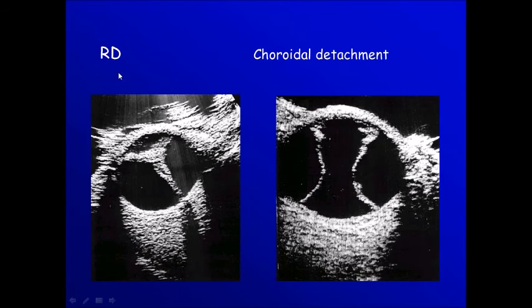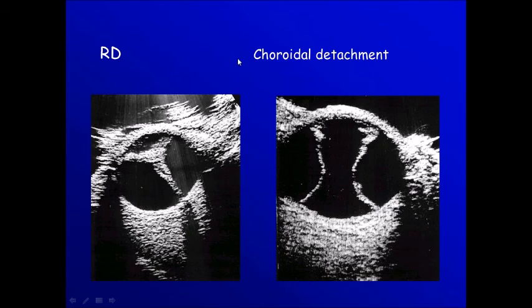To differentiate between retinal detachment and choroidal detachment: with retinal detachment, you follow the membrane to the optic disc. With choroidal detachment, you can see the shape of the detachment away from the disc.